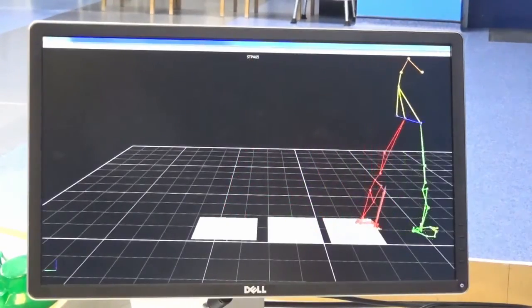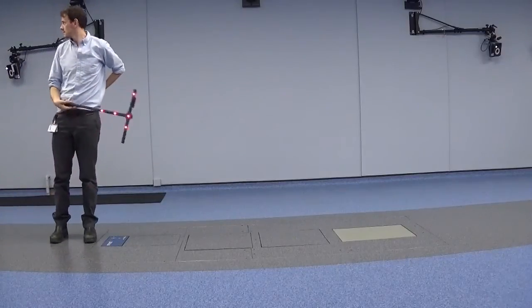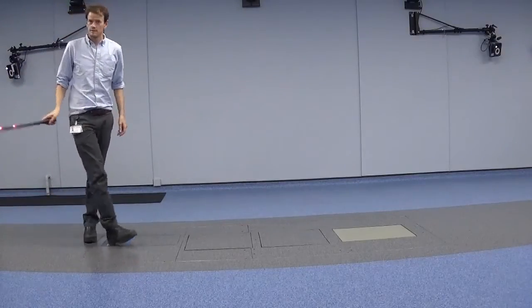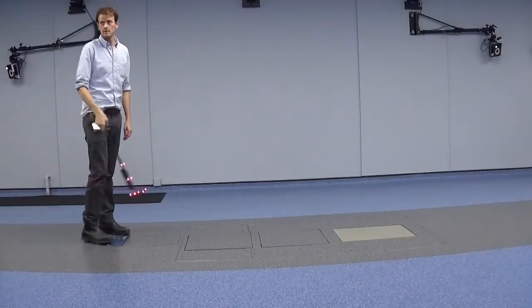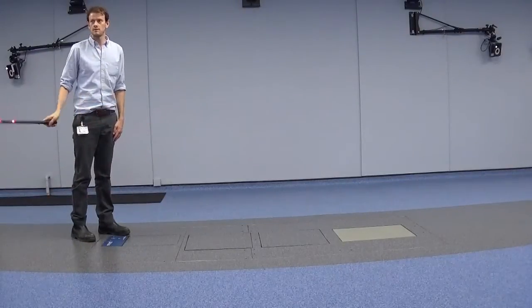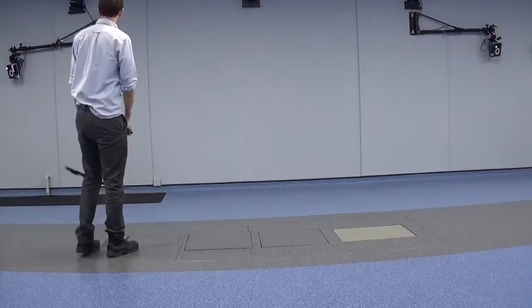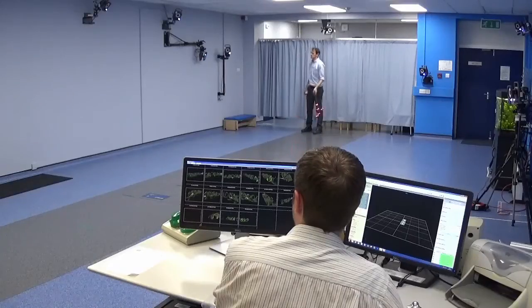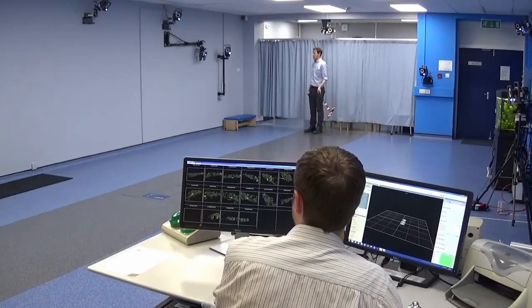Clinical scientists are involved with all stages of the gait appointment. To ensure accurate data is being recorded, it is important to calibrate the cameras and force plates. This is done to ensure they are all synchronised correctly. Clinical scientists then capture the data when the patient is in the lab and afterwards process it to ensure it is meaningful.